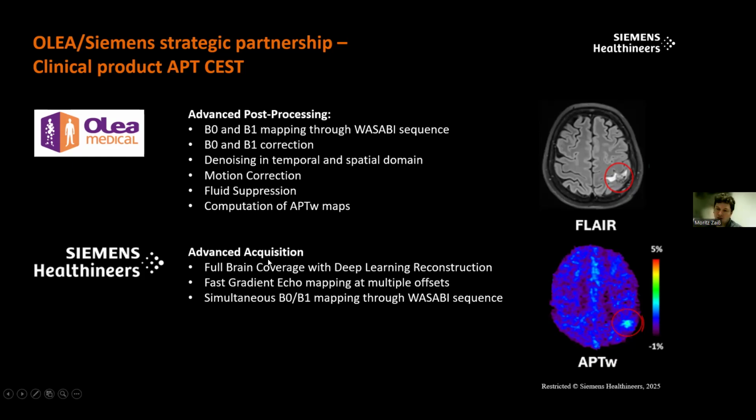And you can then have this with the advanced acquisition, what I just showed you also for Martin's work, which was also done with the Siemens with at least the high resolution things. Yeah, so that's a good development, I think, for us, and especially nice for clinicians who want to apply CEST. But with the Olea tools, you probably can also do more recent techniques.